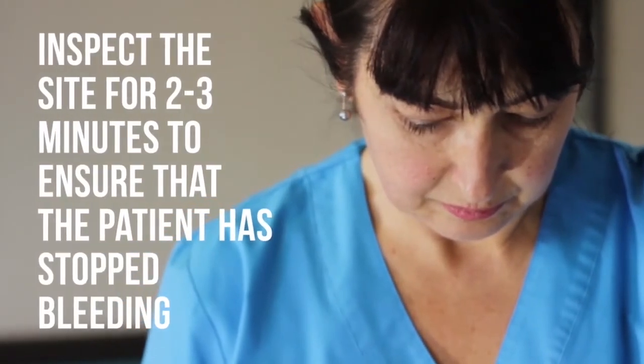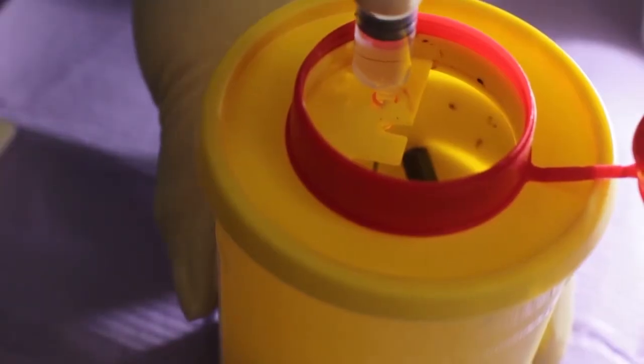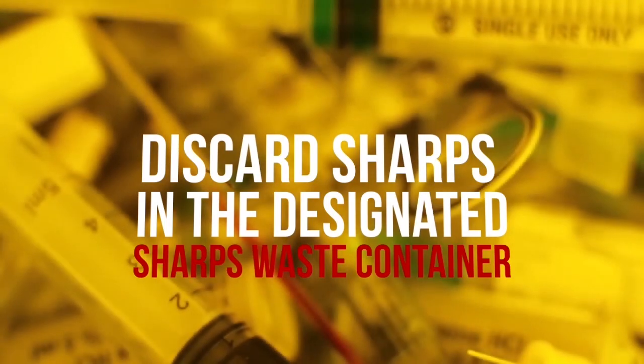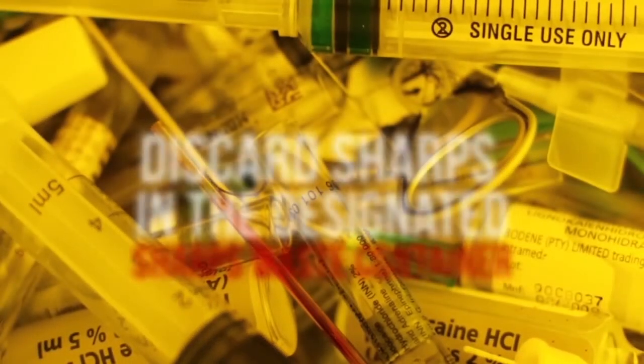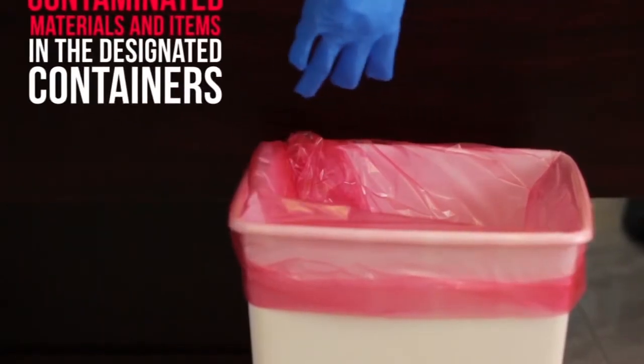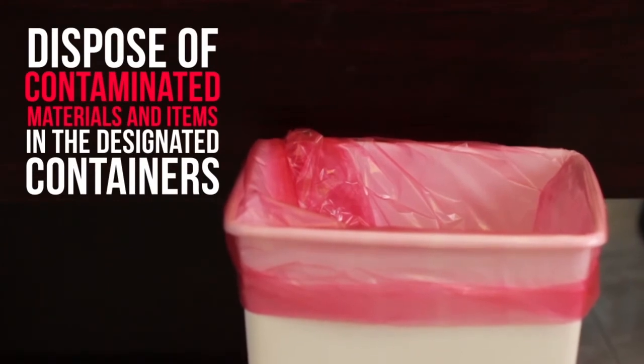Inspect the site after two or three minutes to ensure that the bleeding has stopped. Discard sharps, the used needles, broken glass and syringe or blood sampling device into a puncture resistant sharps container. Place items such as used gloves and all items contaminated with blood or body fluids into the infectious waste.